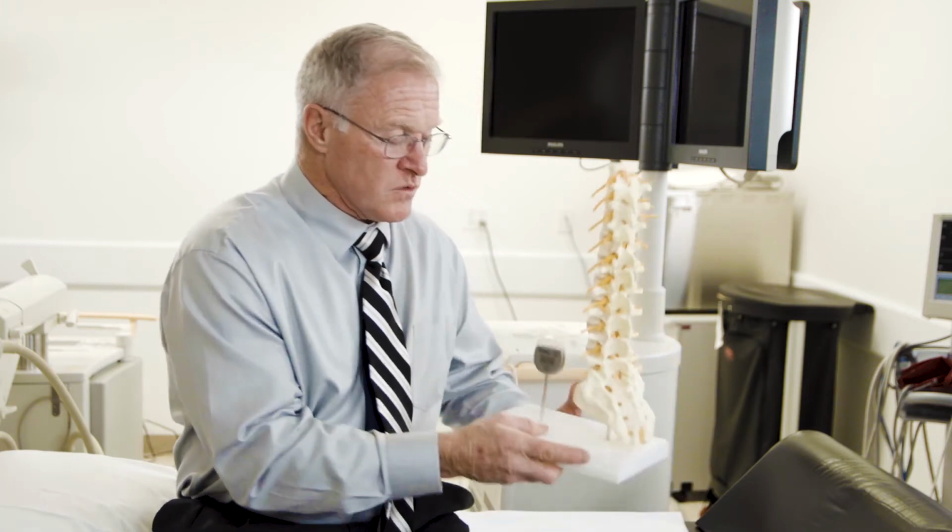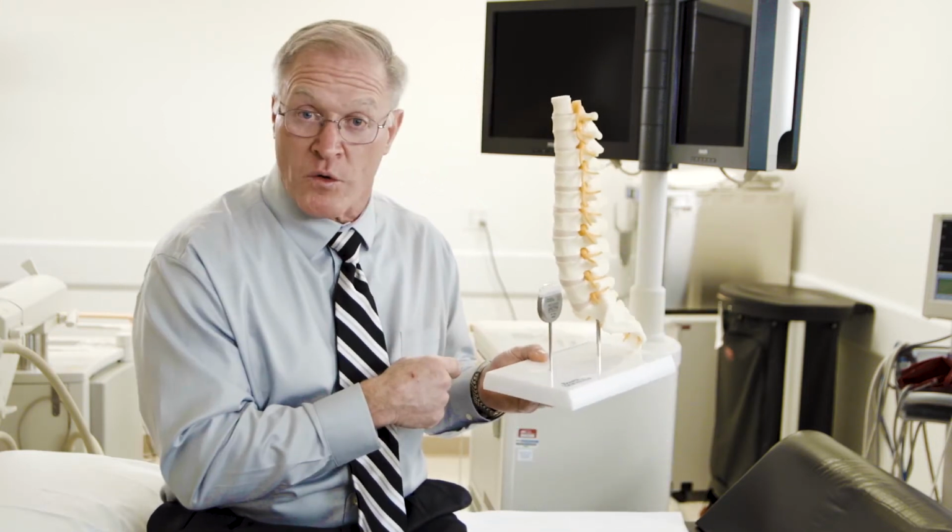But if you are fortunate enough that this treats your pain to a very significant degree, then we can provide you with a permanent implant that can be performed at our Colorado Canyons Hospital Medical Center surgical site. And at that point in time, under light sedation, while you're awake and talking to me, we'll simply numb the skin. We'll place the leads into exactly the same place that they were during your trial, and we'll test it again while you're able to talk to us. Once we're able to confirm that we have the leads where they were successfully treating before, we'll now pass the leads under the skin, under surgical conditions, and make a small surgical incision to place a small battery, which is really no larger than the size of a small Oreo cookie.